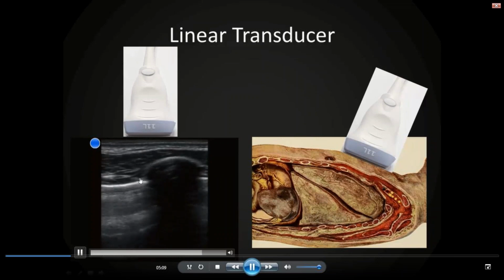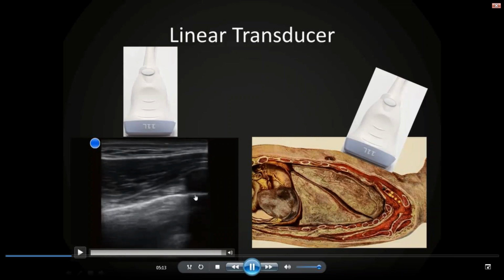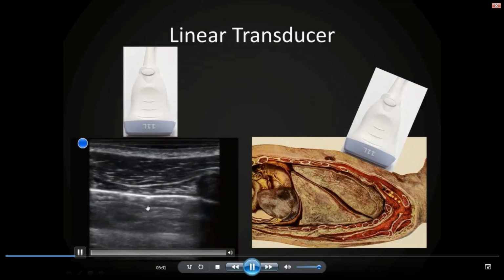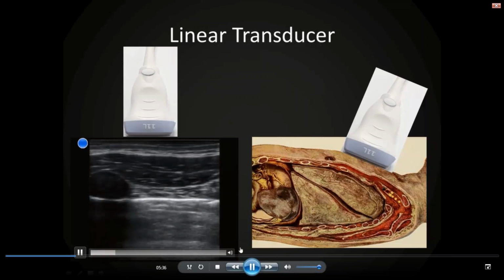You can see the pleural line and actually appears to be moving back and forth. And interestingly, we actually image right through the rib in this case. That can happen despite all of the talks that people have heard about ultrasound not penetrating bone very well. In some cases it can, either in elderly demineralized bones or in the young. Again, we can follow this pleural line all the way around and notice that it's moving.